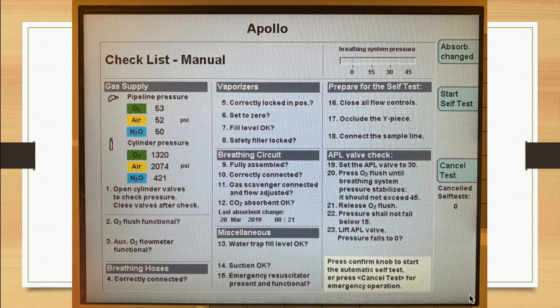Once you've gone through all those steps, all you have to do is hit this self-start button, which is just right here. The picture was cut off. And I know this seems kind of cumbersome and arduous. However, you get pretty fast at doing this once you've done it a few times.